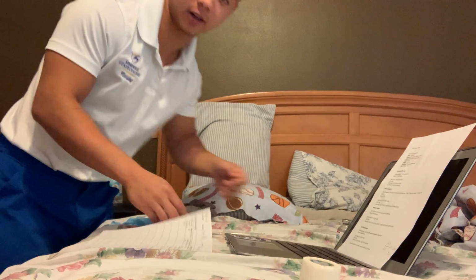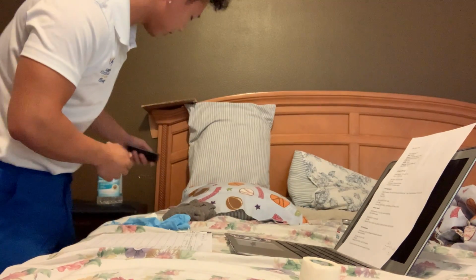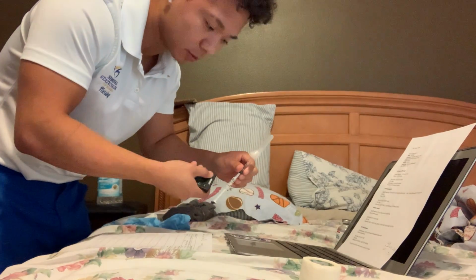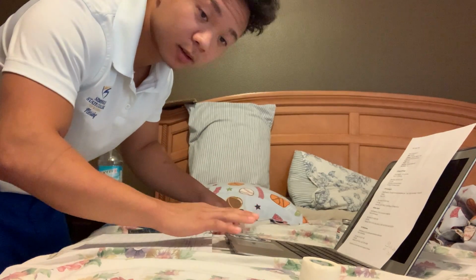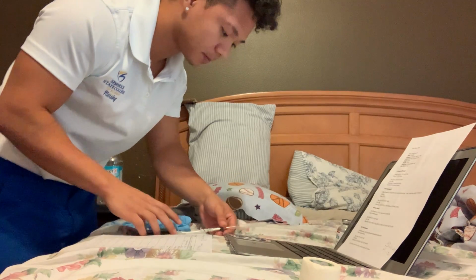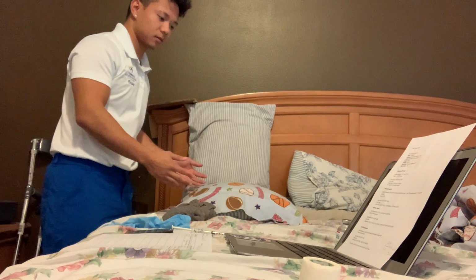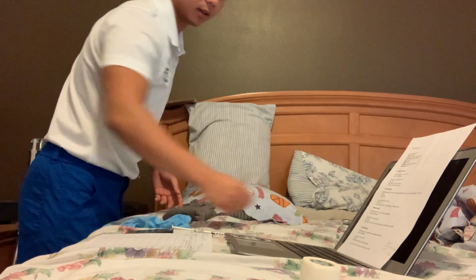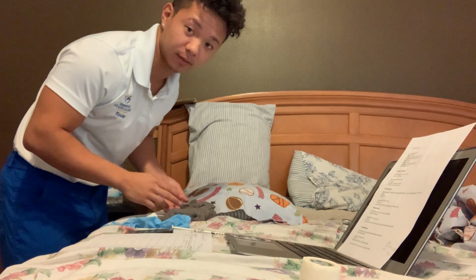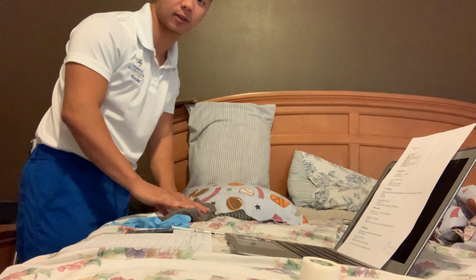So I'm going to scan, this is my scanner. I'm gonna scan the wristband and I'm gonna scan the medication on the syringe. And I'm gonna select start on the computer. And once I do that, I'm gonna position the patient in a way that I can expose the site. So I'm gonna be doing the anterior aspect of the thigh. Here's my injection site.